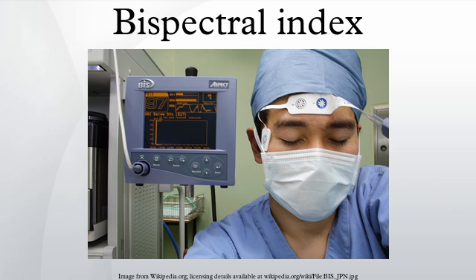When a subject is awake, the cerebral cortex is very active, and the EEG reflects vigorous activity. When asleep or under general anesthesia, the pattern of activity changes. Overall, there is a change from higher frequency signals to lower frequency signals, and there is a tendency for signal correlation from different parts of the cortex to become more random.